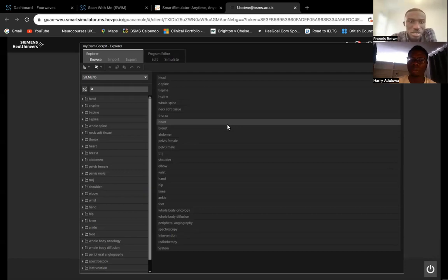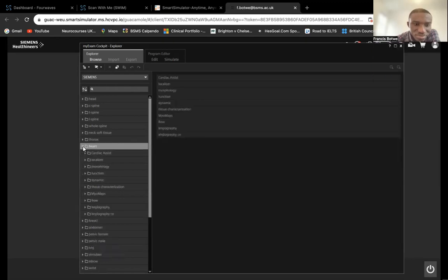So yeah. Well, I think what he was asking is a very important question because there's no contrast injection. We're not going to be able to simulate pre and post contrast, and that's what Francis is alluding to. In cases where you're not able to simulate that, you can hint to the fact that simulation, physiology was also performed, and this is the sequence. This is how it was performed. We don't need to see the images because we know that it's not possible to simulate a contrast injection. So that's what Francis is hinting to without giving away the answer.